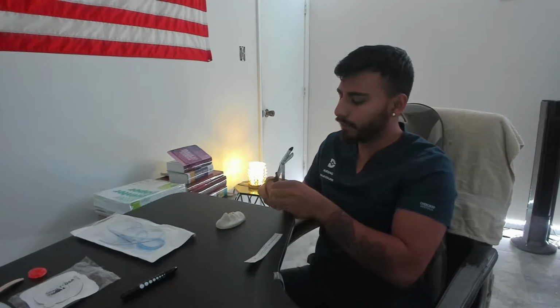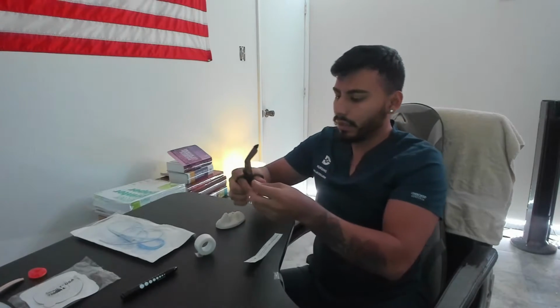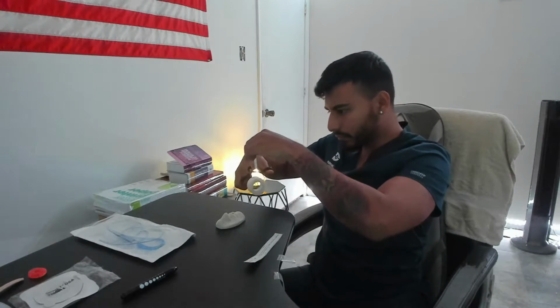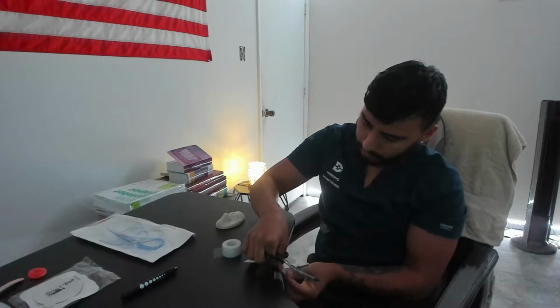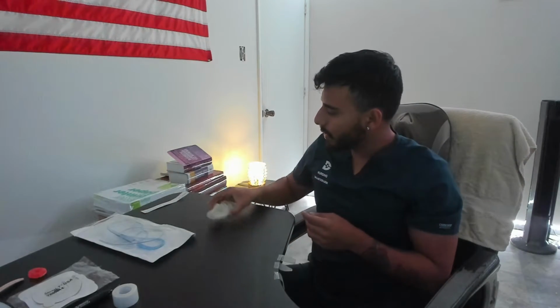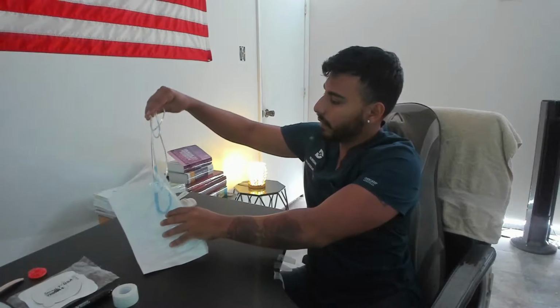Now I'm going to get two separate pieces of tape. One so I can attach the tube to the gown, and the other one so I can mark the tape to where the xiphoid process will be. And I'll put the tape on my bedside ready to use. Once I have my tape ready, just a reminder, I do have clean gloves, so I'm going to take my tube out of my packet.